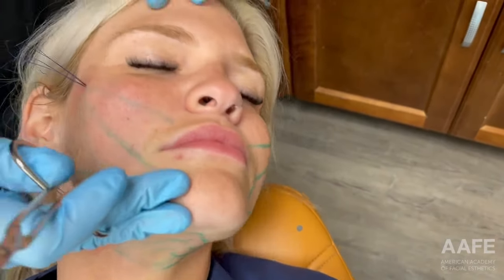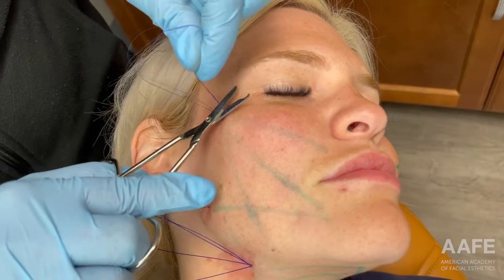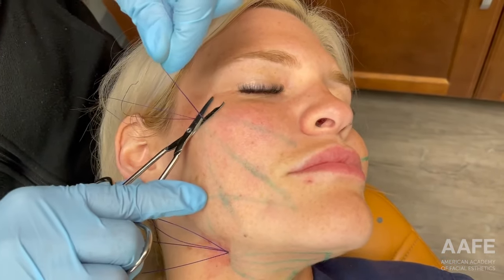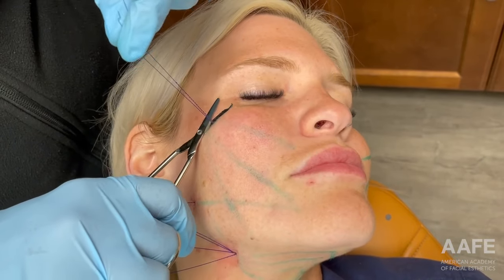I'm just going to clip the threads. It's really important that when you're clipping these threads, you clip them a little bit short. That way the ends aren't going to poke out once we clip them. You can see I'm lifting the thread straight up and then clipping, putting some pressure down on the threads so that when we clip it, we don't see the end of the thread hanging out.